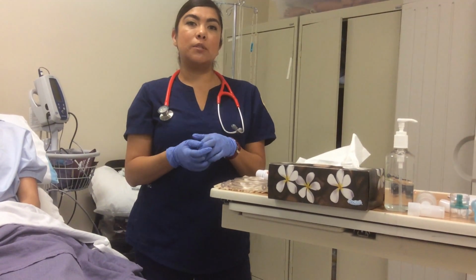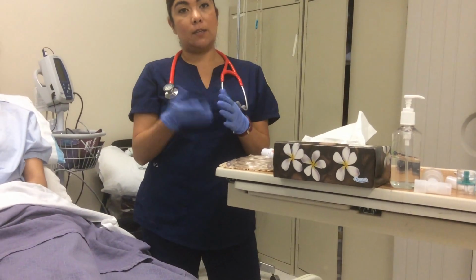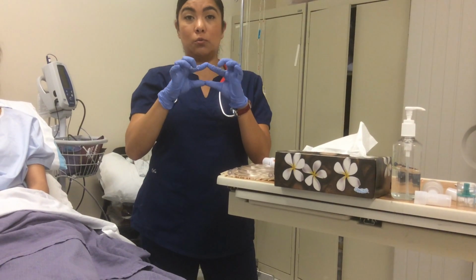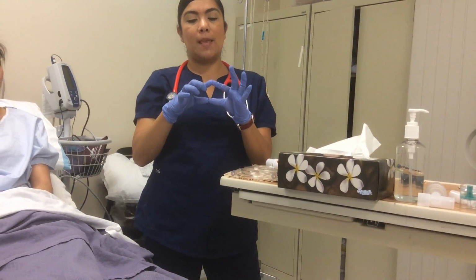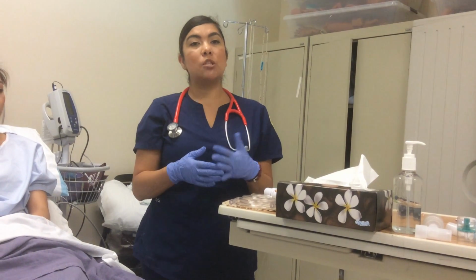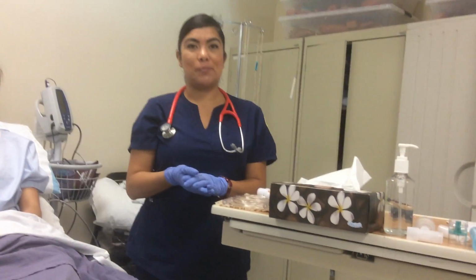That means that it's going to require the patient to take a deep breath in order for the medication to be activated and for the patient to receive the medication. The other, you would be able to turn it, and it would have just a clear triangle, and that would be continuous, and that would mean that it does not require a breath actuation, so therefore the medication will just continue to go on, and the patient will just be receiving the medication.